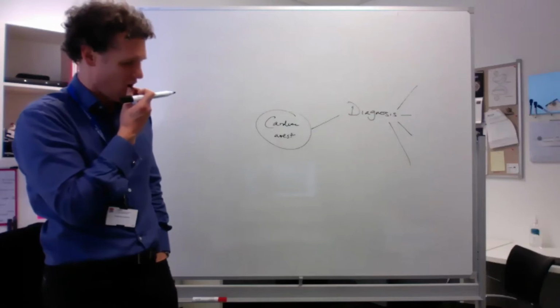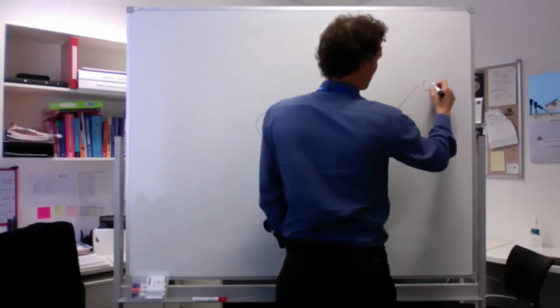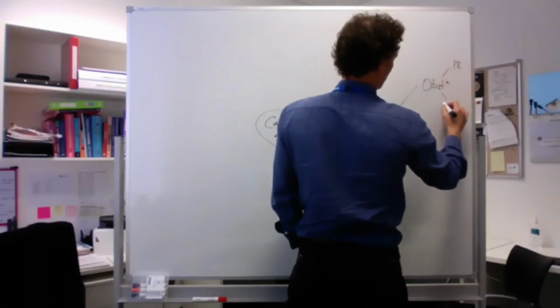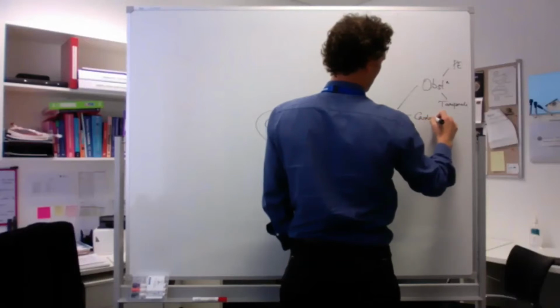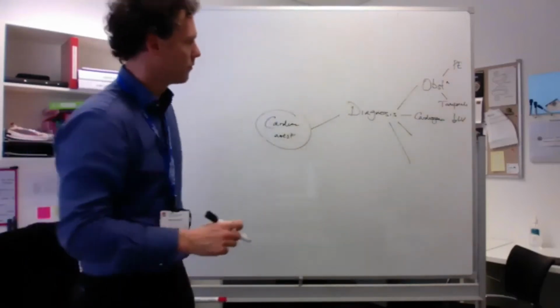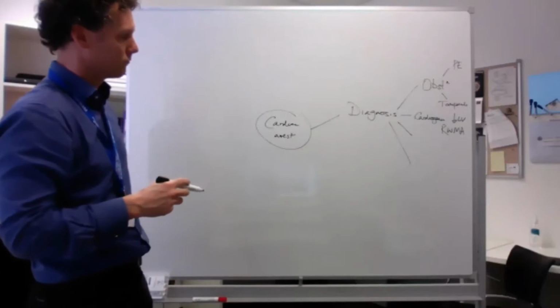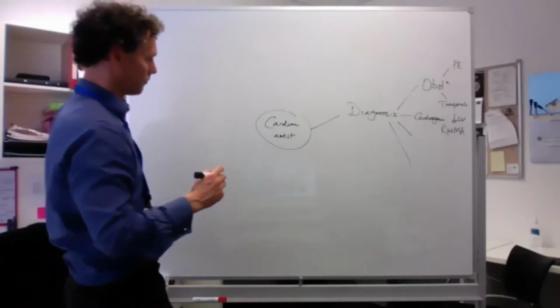Particularly with a PEA arrest, if you think about obstructive causes of shock, you would be thinking about tamponade, you'd be thinking about PE, you would be thinking about a poorly functioning LV for cardiogenic shock. You would be looking for evidence of wall motion abnormalities to help support the diagnosis of a myocardial infarction. I guess also getting prognostic data in terms of what the heart looks like.